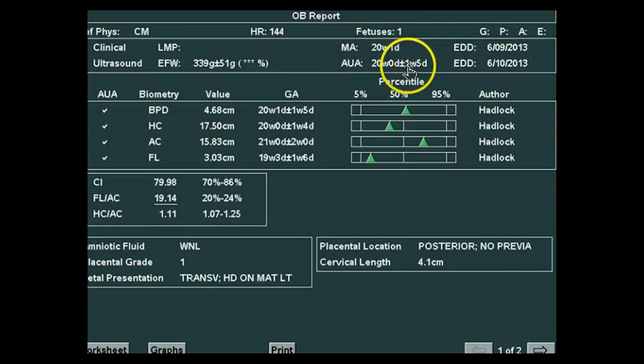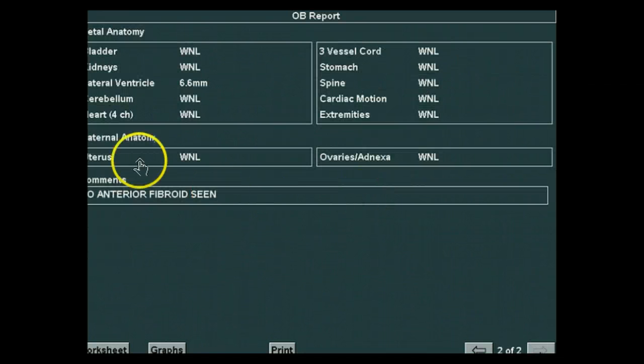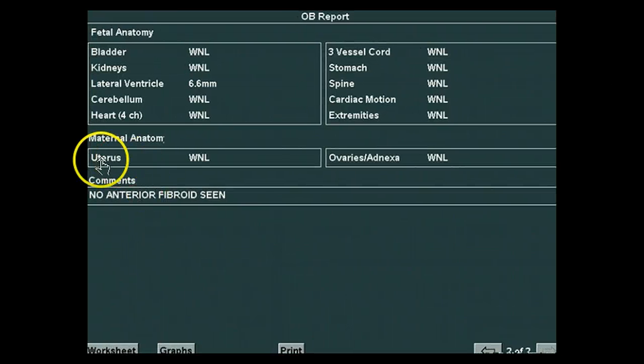Okay, I extended that out a little bit so we could see everything. Bottom line is 20 weeks 0 days is the ultrasound EDD, and the clinical dates are 20 weeks 1 day. Size is consistent with dates. We agreed the placenta was posterior, there was no previa, the cervix was normal, and there was a transverse lie with the head on the maternal left. We agreed with all that. Right, in the history there was something mentioning a fibroid, and she did not see a fibroid, and she mentioned it, which is great.